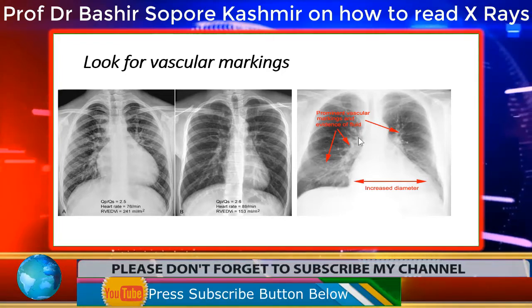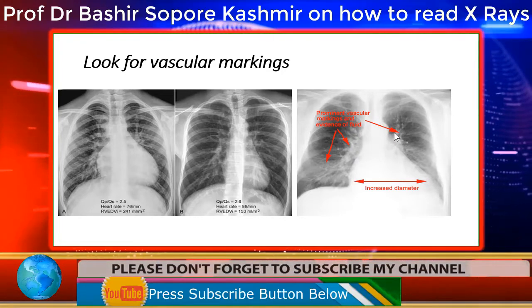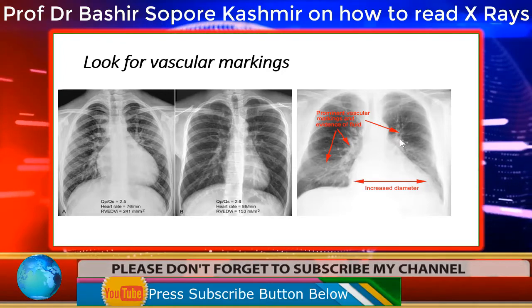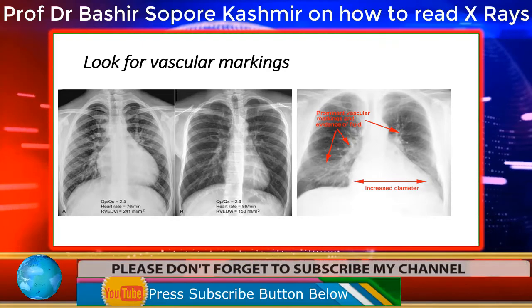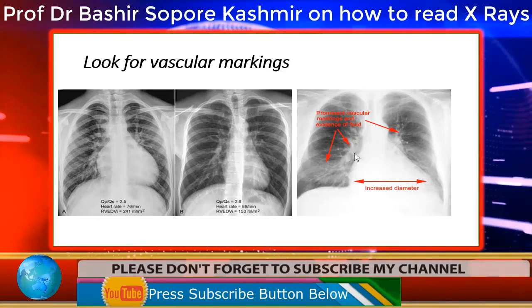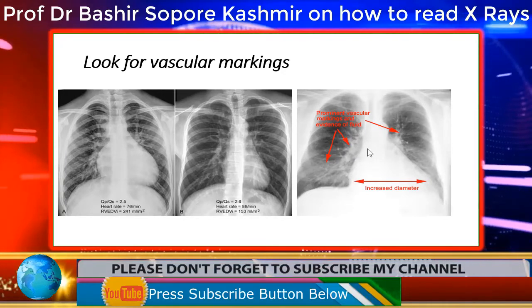And we can say that the hilum also is prominent because, as I said, the hilum is made up of the pulmonary vein, pulmonary artery, and right and left bronchi. So when vessels are congested or enlarged, their vascular markings will also become prominent.